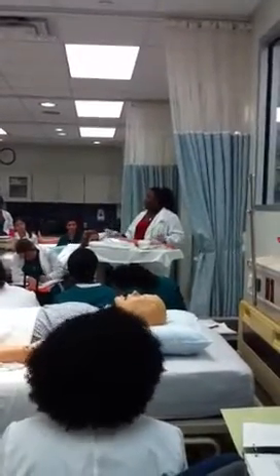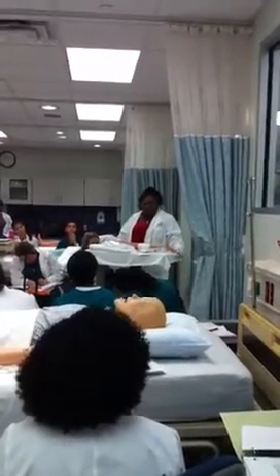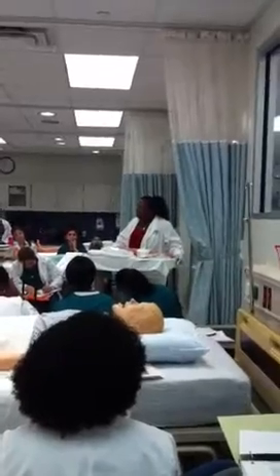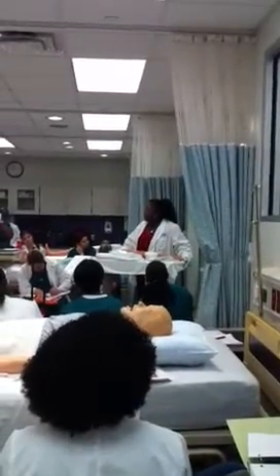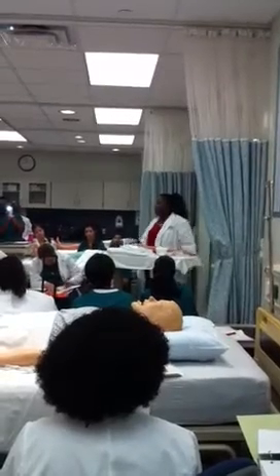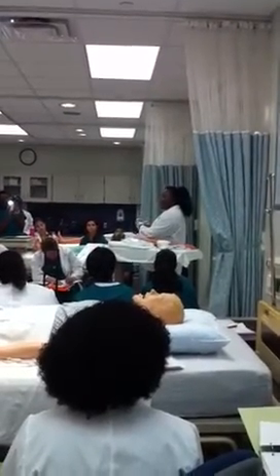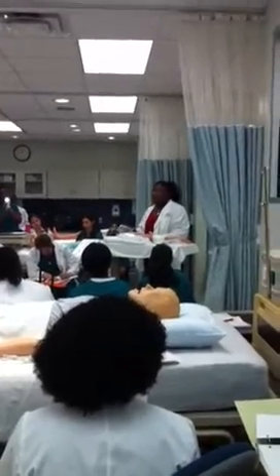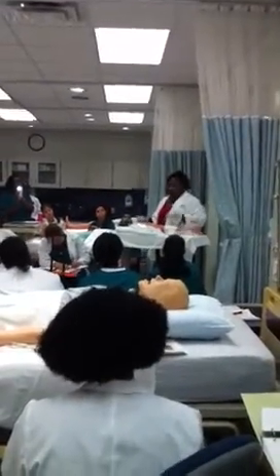I'm done with that. All right, Miss Smith, I'm done. Lower the bed, put the call bell within reach. Is there anything else, Miss Smith, that I can do for you before I go to my next patient room? This is your call bell. I'm going to take off my gloves, wash my hands, and I'm going to sign that I gave that medication. Signing meaning documenting.